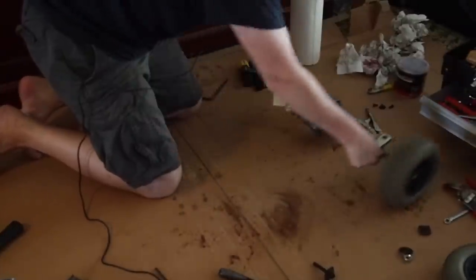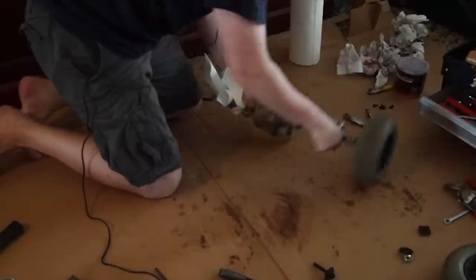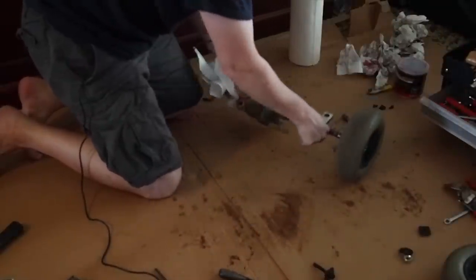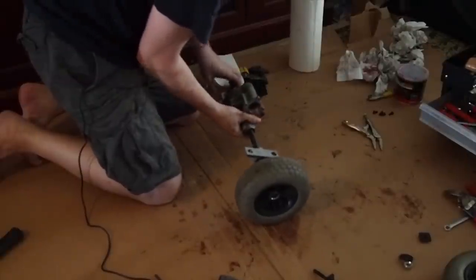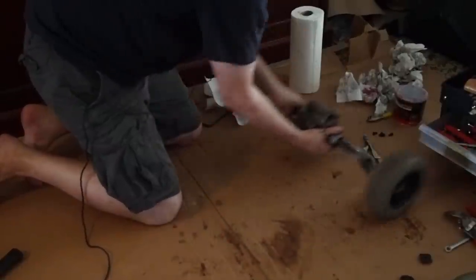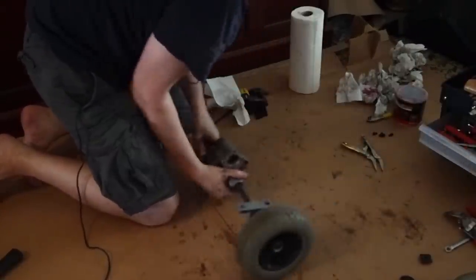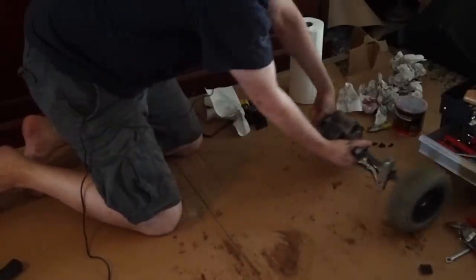So me holding one side, this is if you were in a big turn, and one side was just going and the other side wasn't. That's not going to happen very often. What's really going to happen is both wheels will turn at the same time. So there is a bit of noise when I do that, but it just sounds like gears.